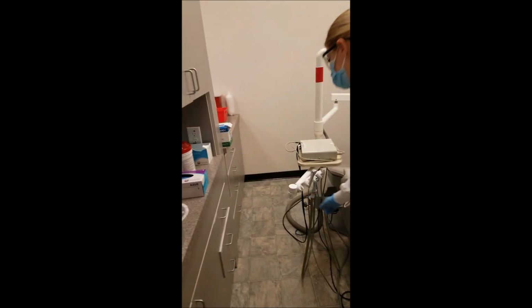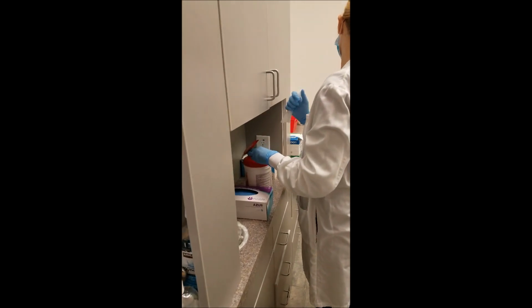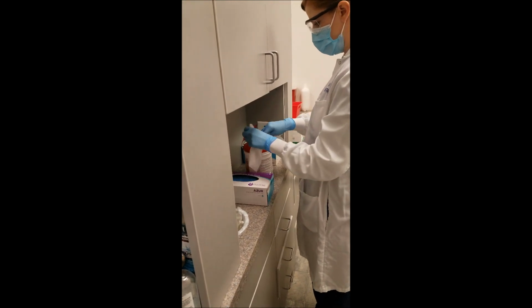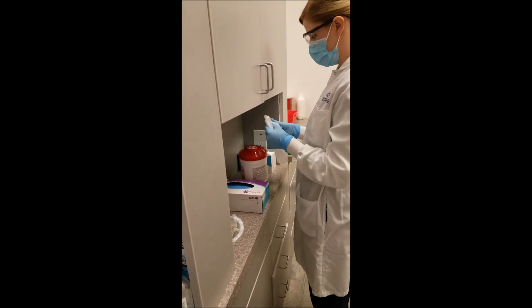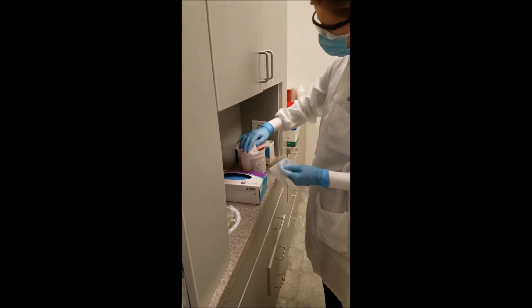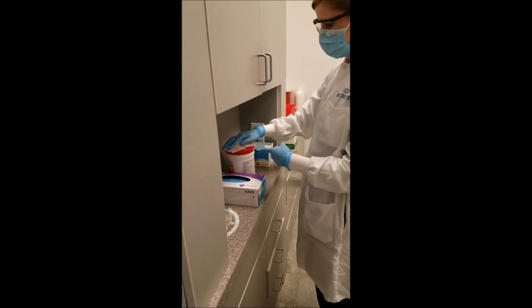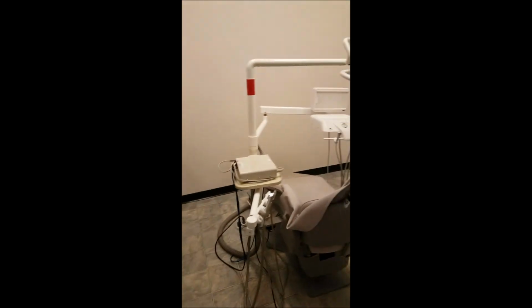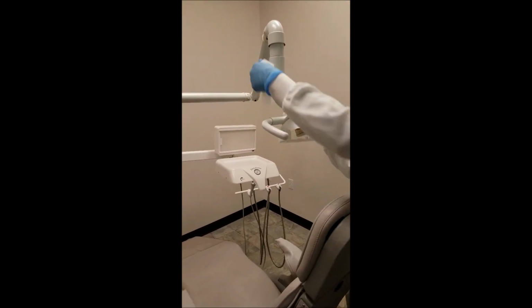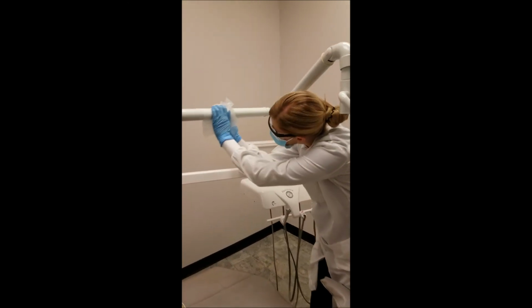Then she will obtain, turning her head to avoid splashing her eyes, 1 disinfectant wipe for each hand. And she will take caution not to touch any clean surface with gloved hands, and she will need more than 2 wipes, as surfaces must stay wet for 5 minutes. She will carefully disinfect all surfaces, including the lid of the wipe container, every time she takes out the wipes. Then she will start with the light handle and arms. Not skipping any sections.